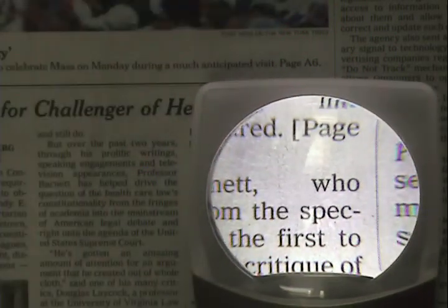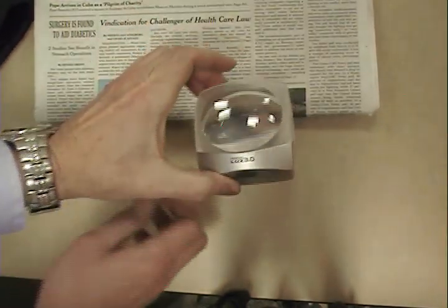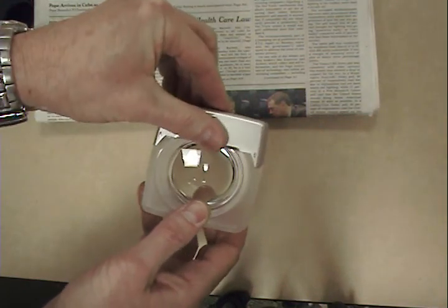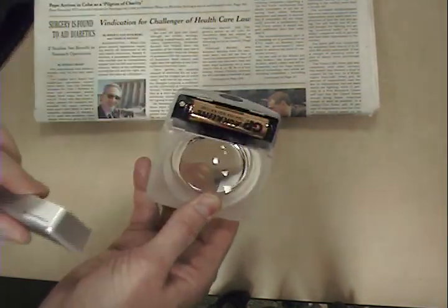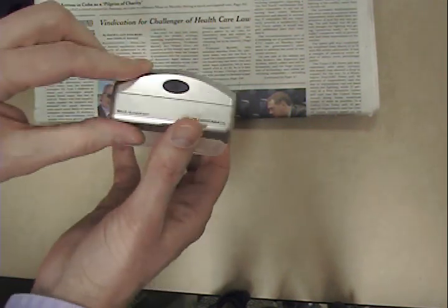The Minus Lux is one of the lightest illuminated magnifiers on the market, since it only requires one AA battery and weighs only 4.5 ounces, which makes it very portable and easy to take with you wherever you go. Just slip it in your pocket or purse.